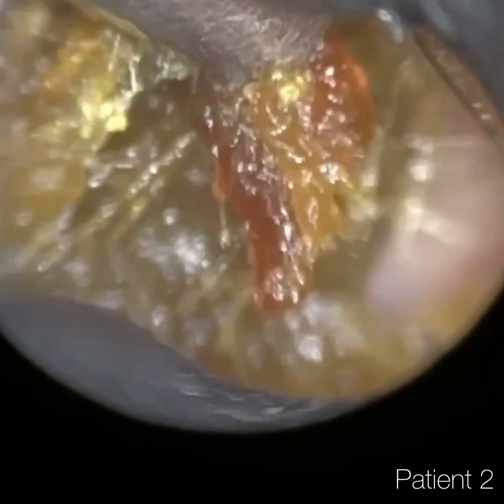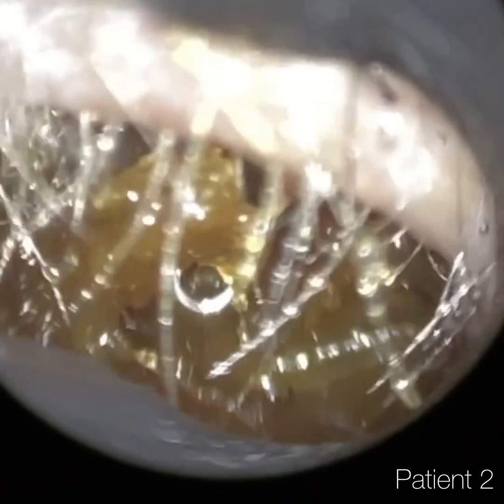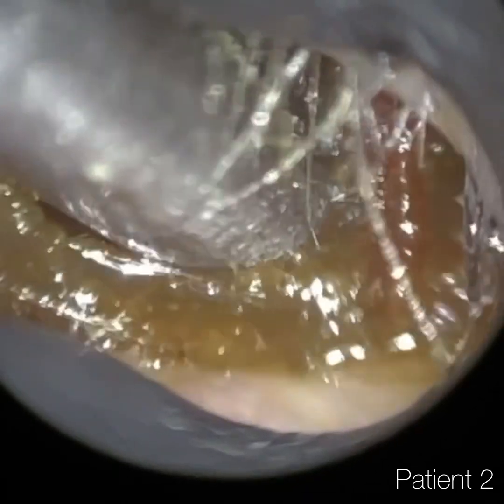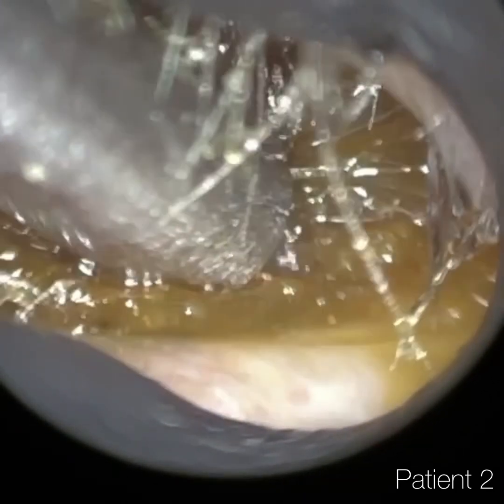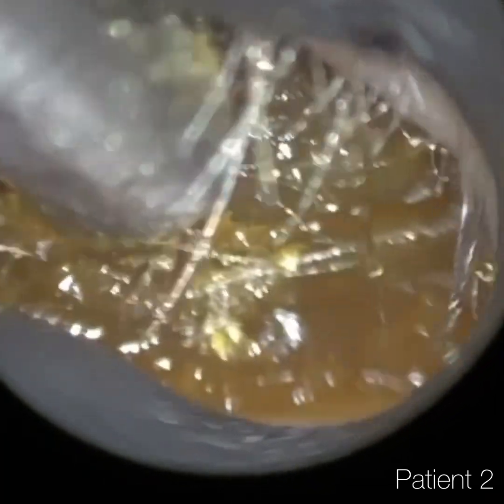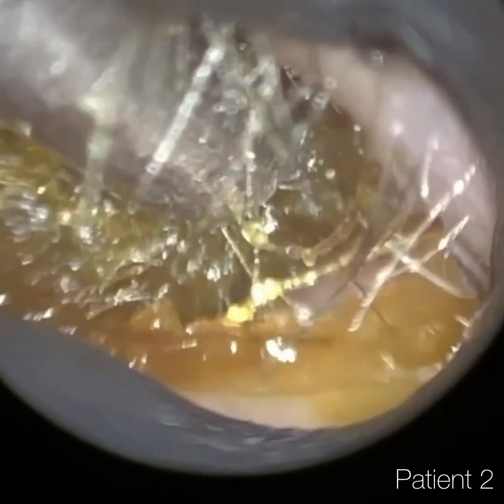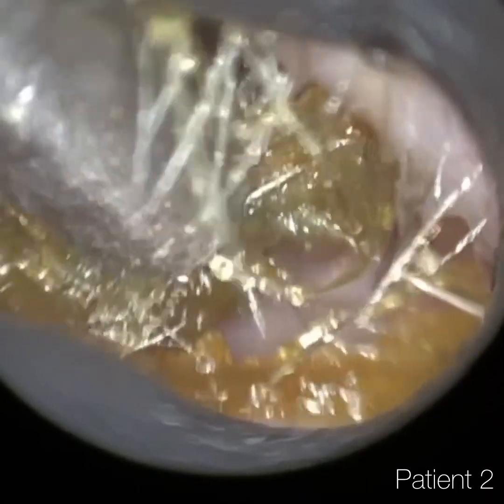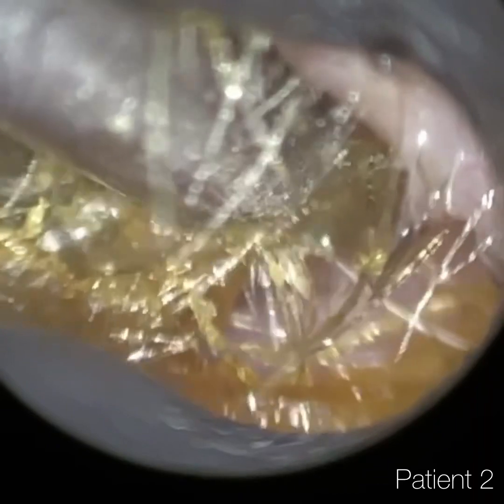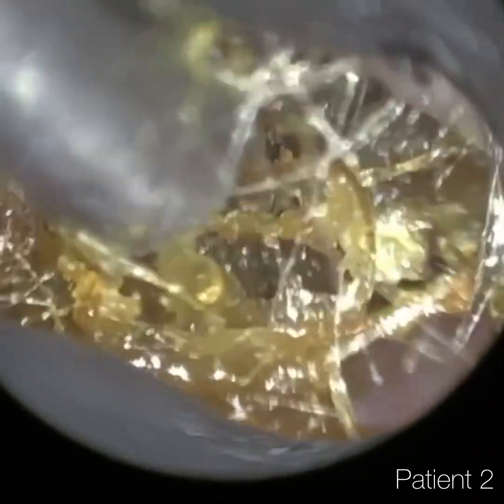This patient has got very sticky wax and very matted wax. There's also a lot of dead keratin. We know that by the consistency and the appearance — the shine this wax has. It's very glossy. And when it's glossy, that's actually dead skin. Dead skin goes through a phase of almost becoming like caramel in consistency, and it also gives off a glossy appearance. That's what this patient has in this left ear. I'll just use some drops to lubricate the ear and help loosen the wax and keratin off the canal wall.